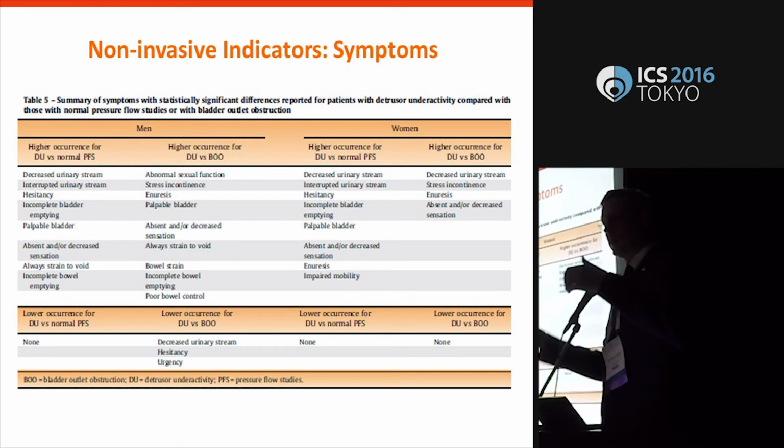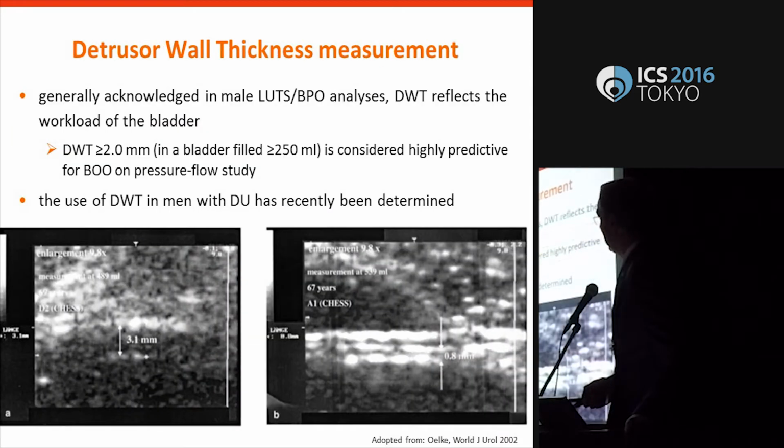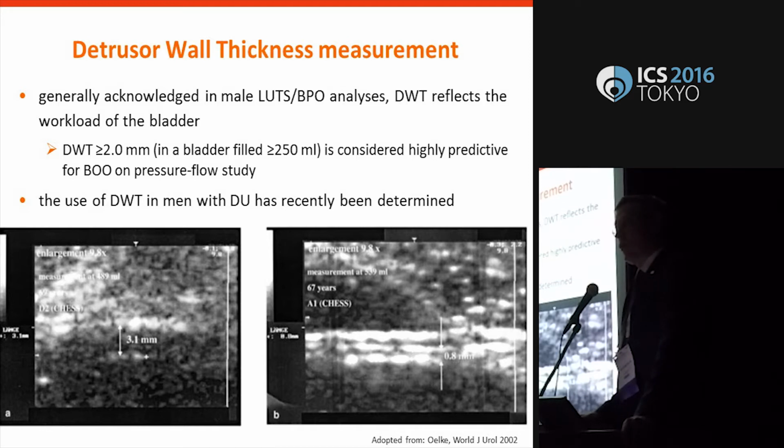If you have to weight the symptoms, this is still open for discussion. There's going to be a questionnaire out soon, I think. I participated in this prospective study to evaluate this questionnaire. I have not seen the results yet. But what I would like to show you is a non-invasive test with ultrasound detrusor wall thickness measurement.